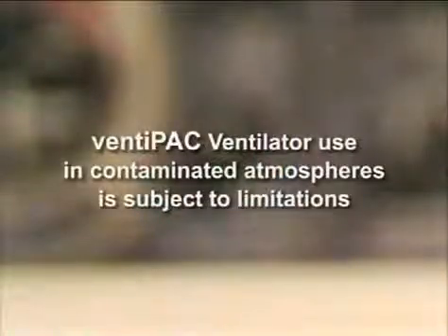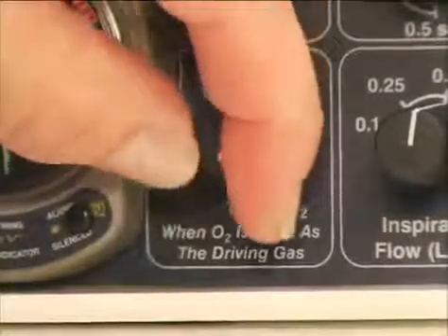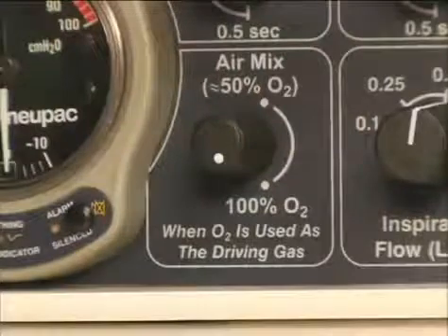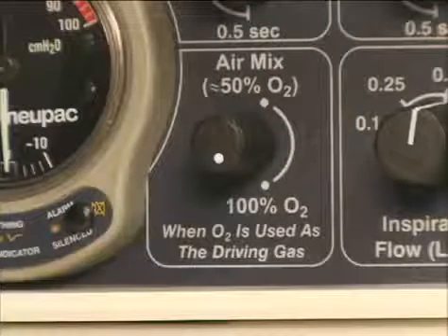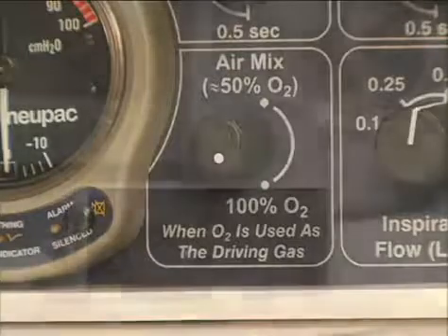You can use the ventiPAC in contaminated atmospheres, subject to certain limitations. If you are using this equipment in these areas, you should clearly understand these limitations. In any environment where you suspect contaminated air, set the ventilator to the 100% oxygen mode. This setting assures that a minimum of ambient gas can enter the breathing system.